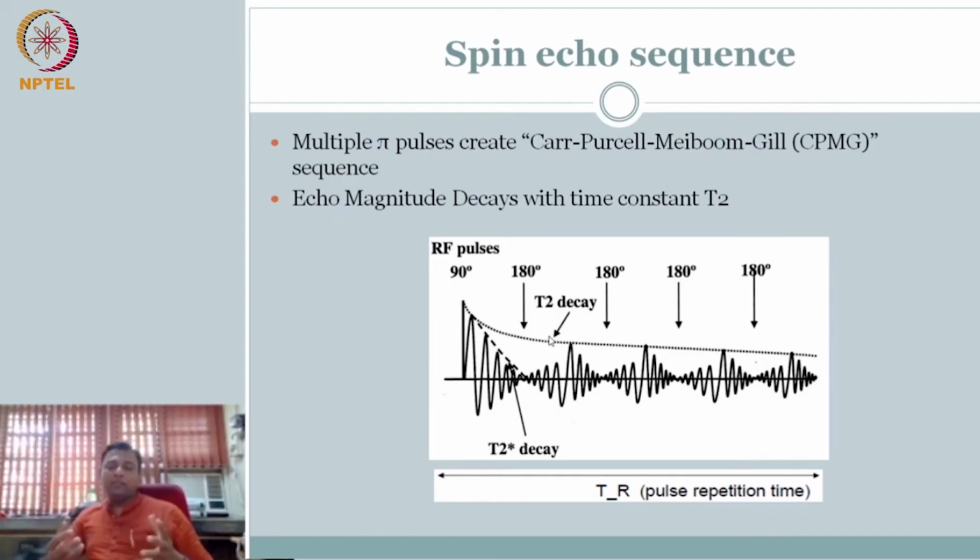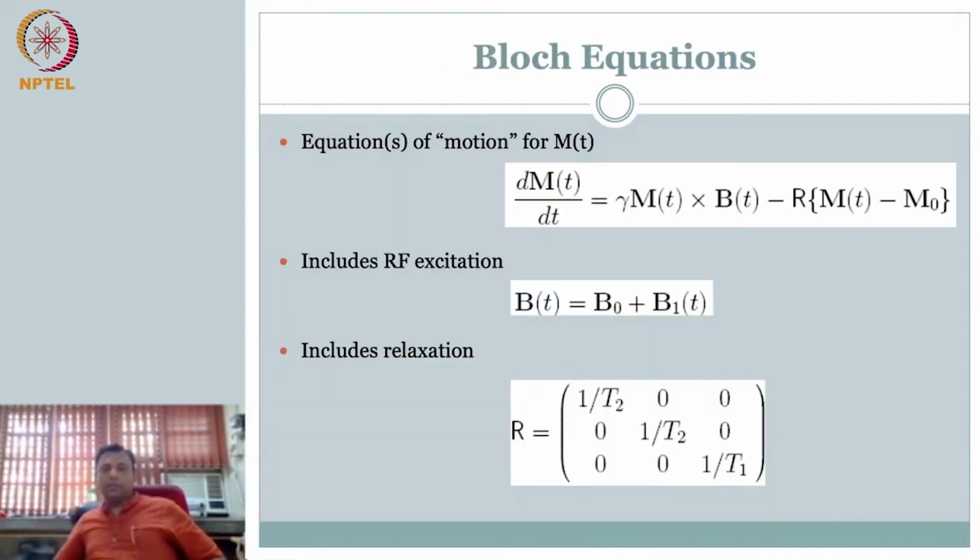Essentially, you manipulate this with an idea to exploit whether you want to get the T2 characteristic of the signal, the T1 characteristic of the material, or just the proton density is good enough, right? So all these can be manipulated using the pulse sequence diagram.